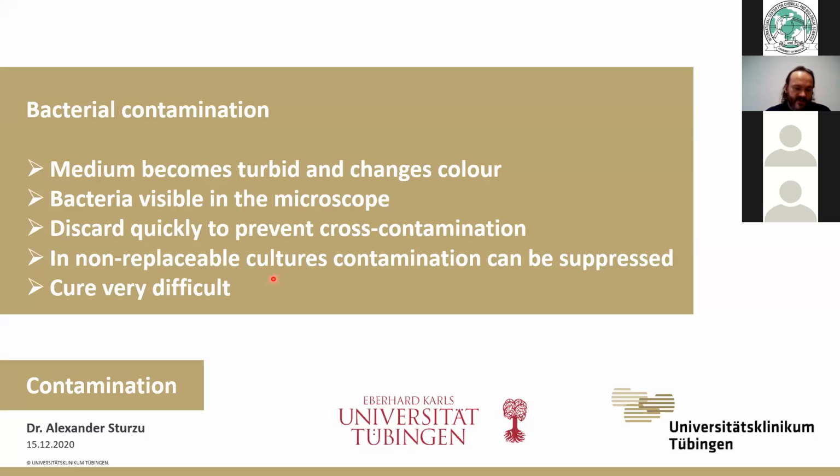So if you really wanted to try and cure the bacterial contamination, you would have to go through many, many cycles of splitting and diluting the cells, in the hopes that once you keep the bacteria from multiplying and you keep diluting your cells, at some point in the new dish you will have just cells and no bacterial contamination. Since this is very difficult, it would be better, if you have the possibility, to just go back to your frozen stock and start your cell culture from a new sample.